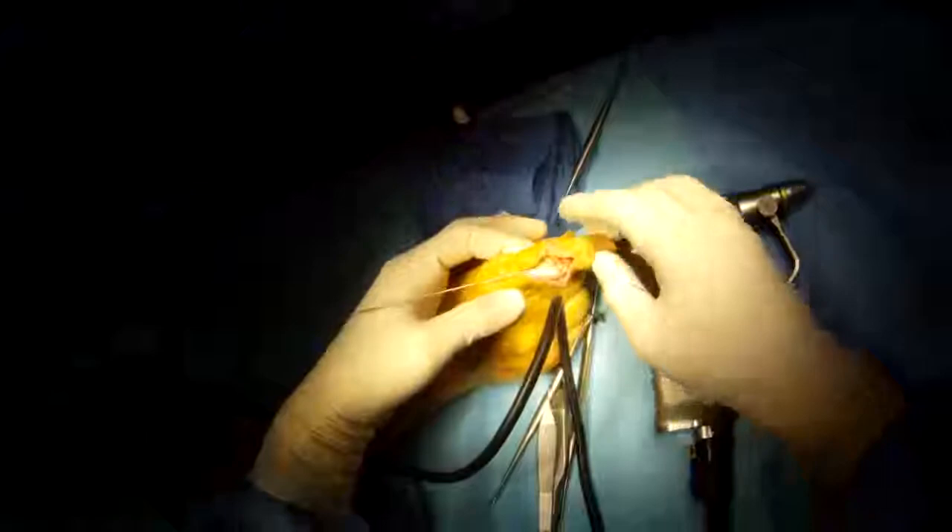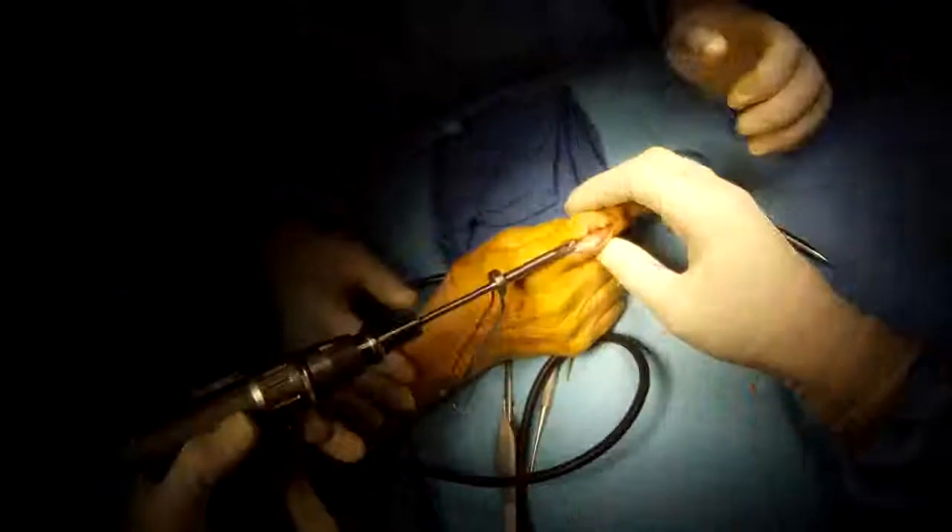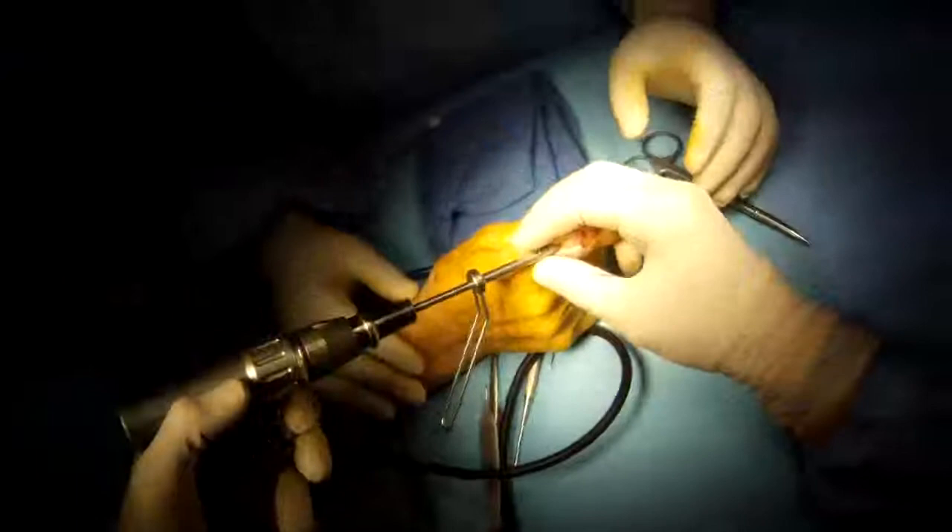Put the finger together in the desired position, and then pass the wire through to the bone on the right. It's a good position — nice and firm.